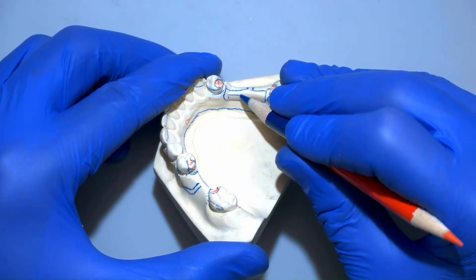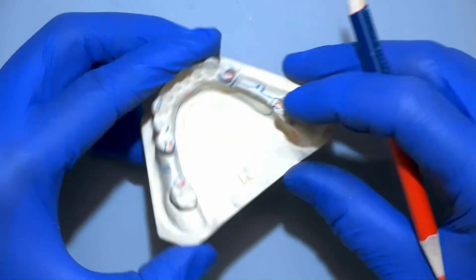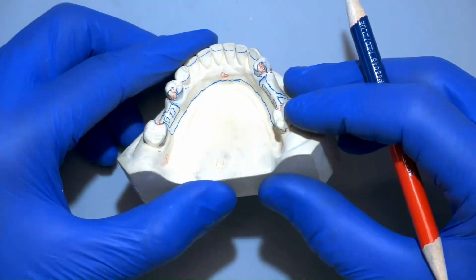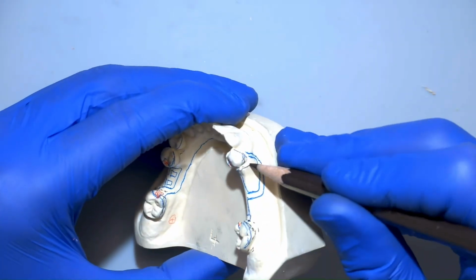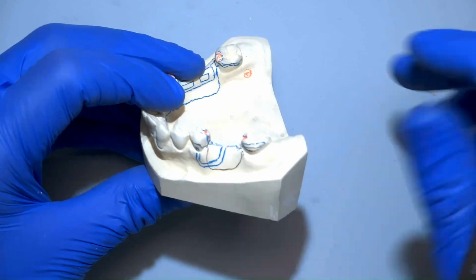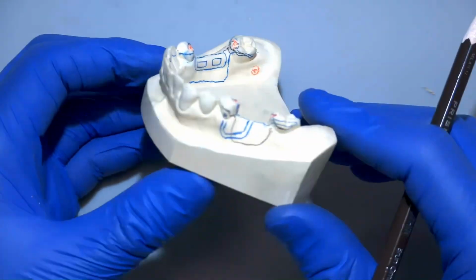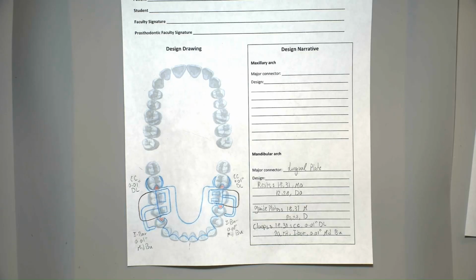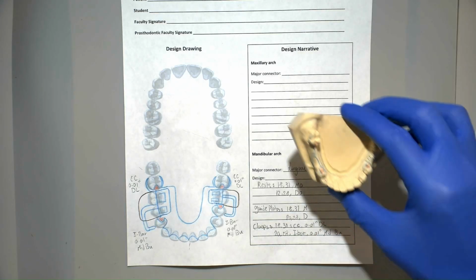We're going to also add the two openings to highlight the shape of the lattice, and we'll do the same thing on the other side. Now finally, we're going to add the acrylic resin denture base by using the brown pencil going around the elbow of those eye bars, and with that, the final drawing is done. And as you can see, it coincides with the paper drawing. You're now ready to go into mouth preparations.